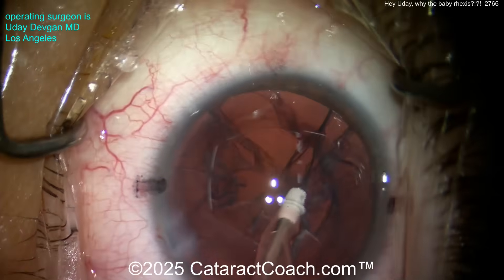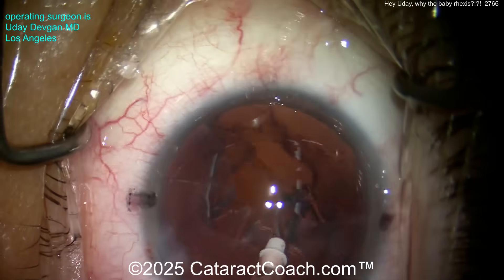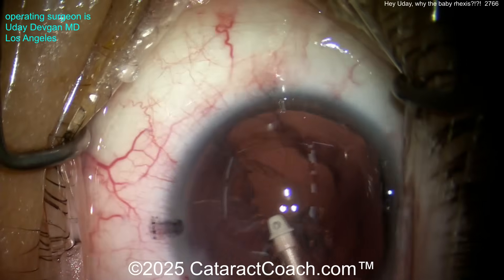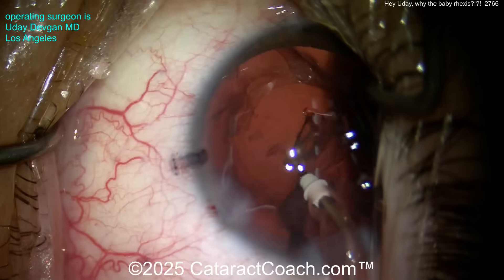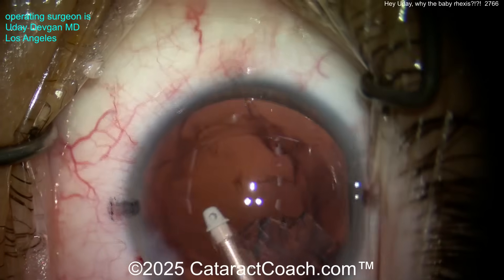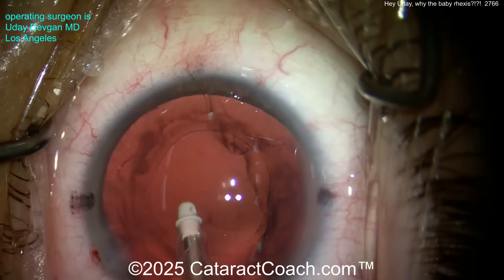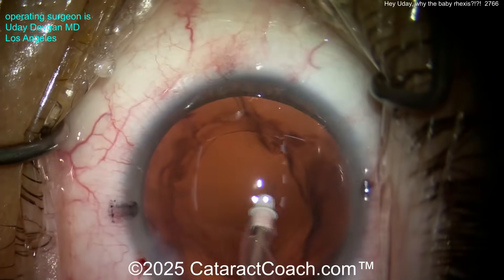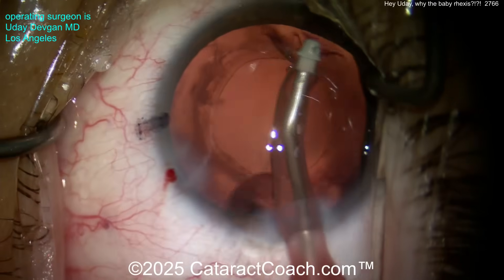Now going in here moving the cortex. I'll show you at the end of the case — this is not a baby rhexis, this is a perfect rhexis, exactly the size I wanted. We measured many times. Eyes are all different; you need to be measuring that rhexis right. Think about a smaller eye with an 11-millimeter white-to-white and poor dilation — you can't go by pupil size to determine rhexis size. You need to actually measure it out.